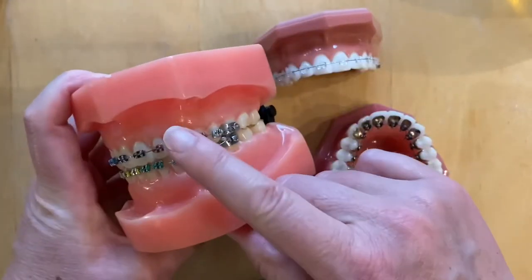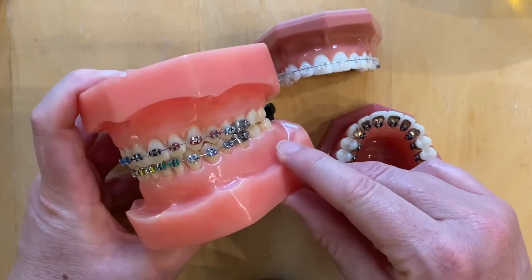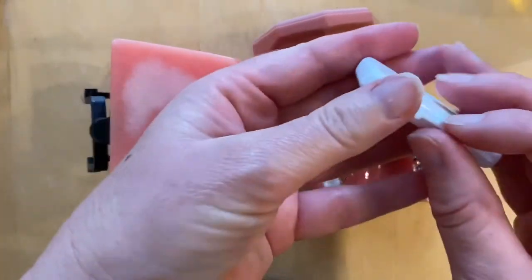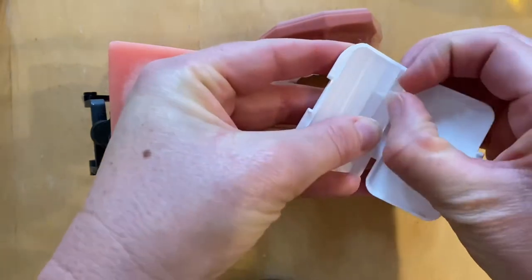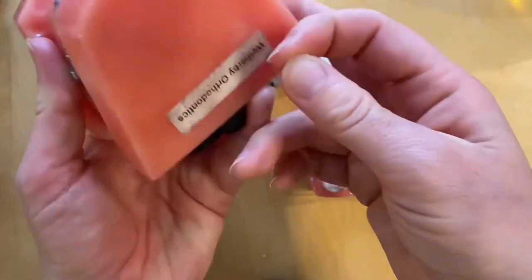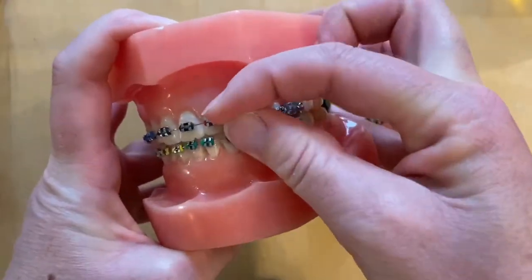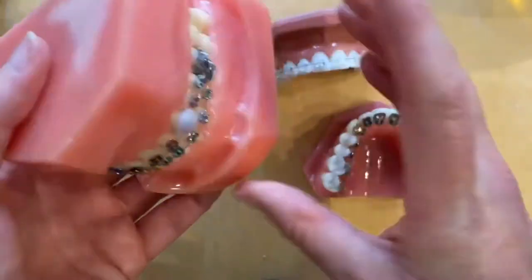You might also find that some of the braces feel a little bit rough and might rub on the inside of your lip, cheek, or tongue. There are a couple of ways to help reduce the discomfort. You should have some wax - take a small piece, soften it up in your fingers, and push it onto the bit of brace that's rubbing. Squash it on and squeeze it around the corners to cushion your cheek and make it feel a lot less uncomfortable.